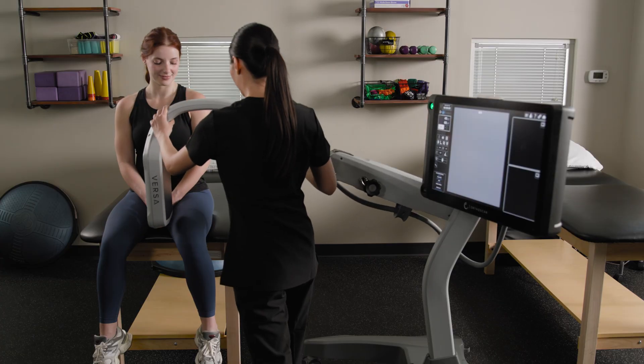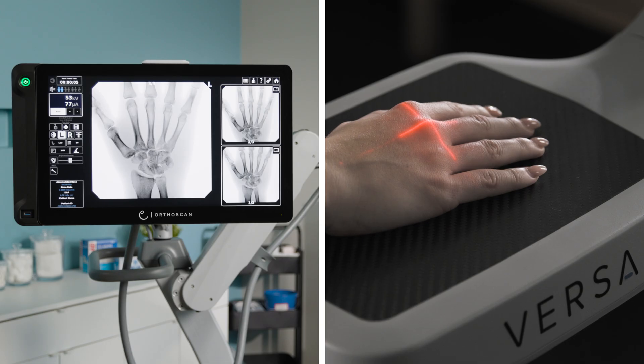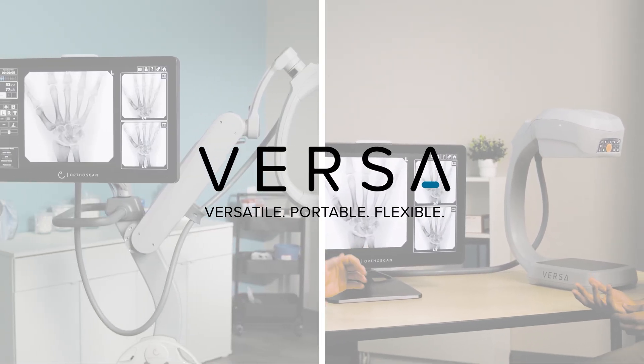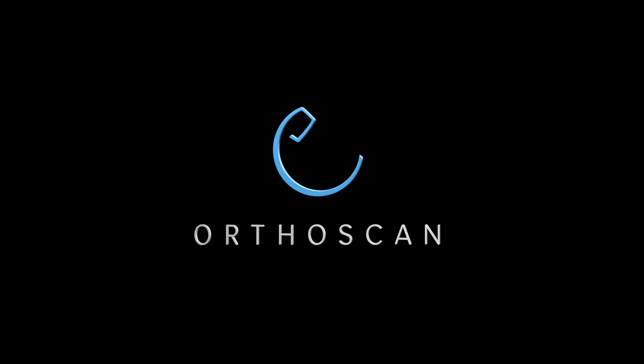Enhance the doctor-patient experience while streamlining your clinic's workflow with the OrthoScan Versa — the versatile, portable, and flexible solution for digital x-ray and fluoroscopy. The Versa Mini C-Arm.